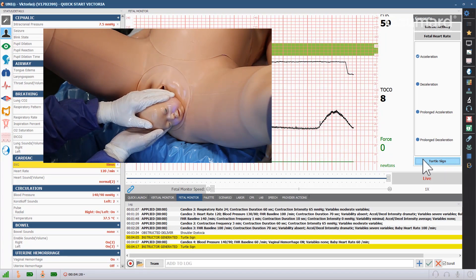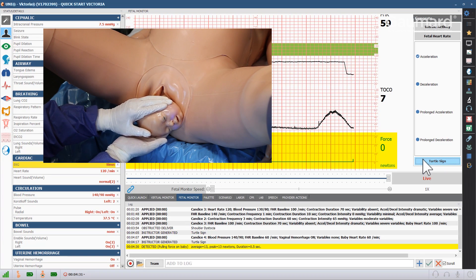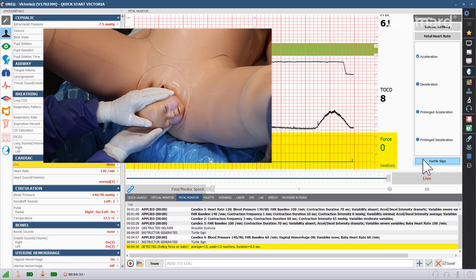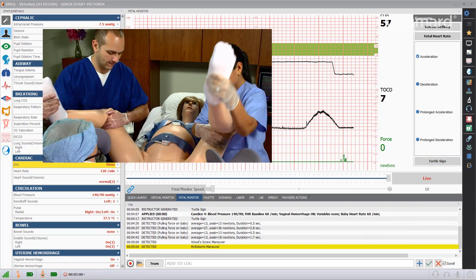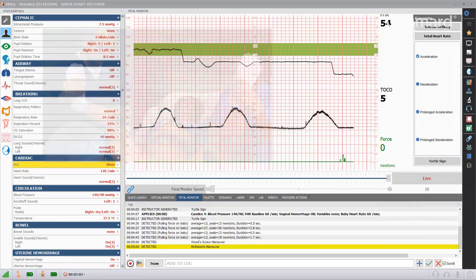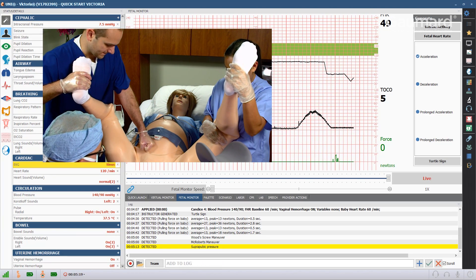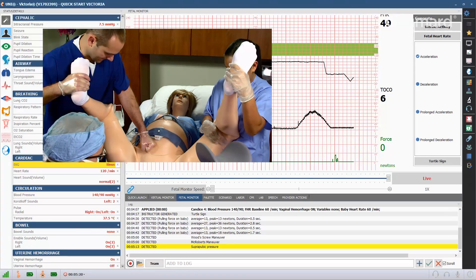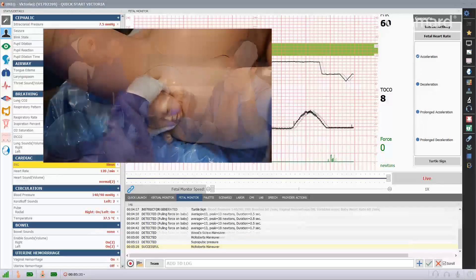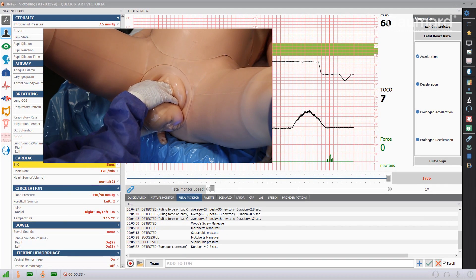Victoria will automatically detect and log any pulling forces on the head of the birthing baby during the delivery. Victoria will also automatically detect and log McRoberts maneuvers. Suprapubic pressure will be automatically detected and logged in the software. Victoria will automatically detect and log the wood screw maneuver.